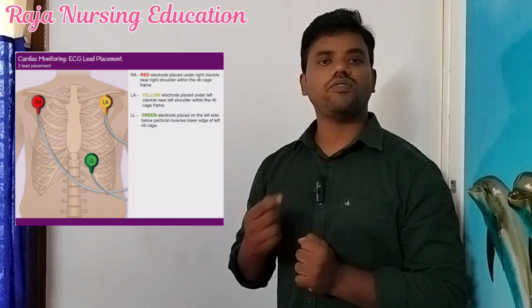Especially in cardiac arrest, first we have to check for the carotid pulse, whether the patient is having a pulse or not. Then we have to bring a defibrillator and connect the 3-lead defibrillator. In the defibrillator, you can analyze the rhythm. If the patient is in VF or VT, it means we have to deliver a shock to the patient. To deliver a shock, we have to follow some steps before doing defibrillation. Let's know what steps you have to follow in case of defibrillation.